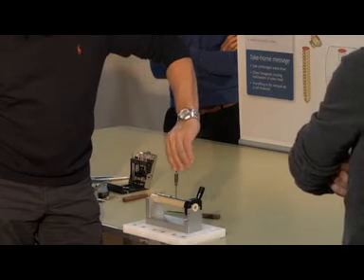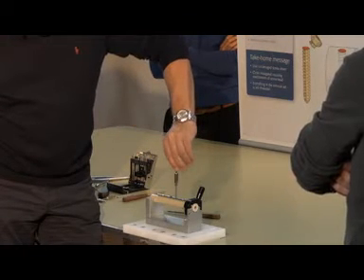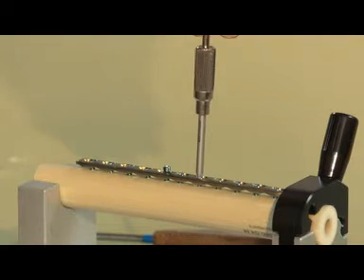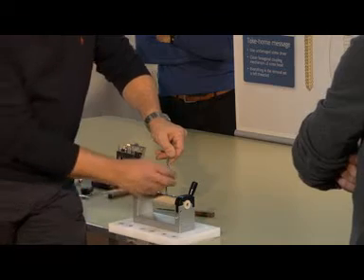You see, now it is engaged and I can just turn. And by turning this, I can remove the screw.